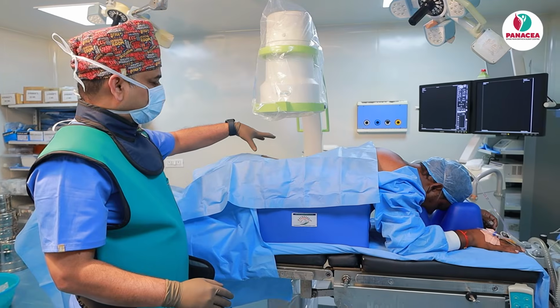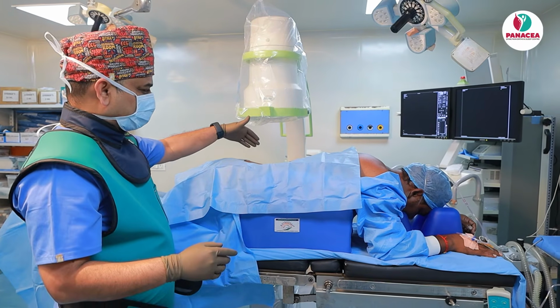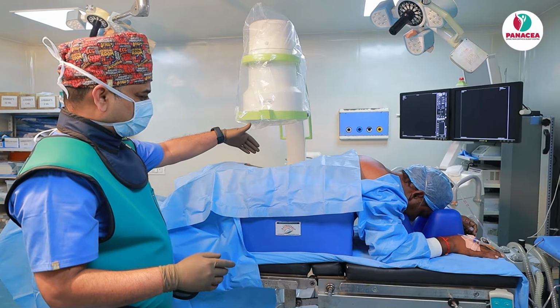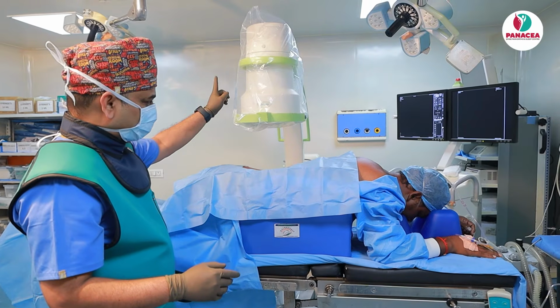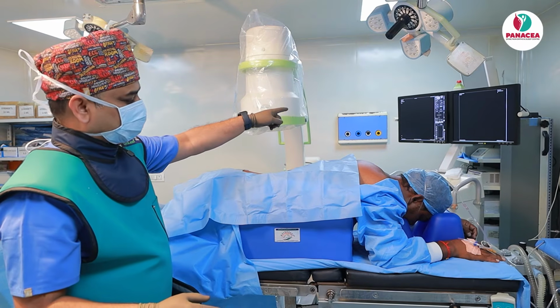Now it is scrubbed and draped. You can see the ergonomics. The patient has got left side symptoms, and we're going to do the pain intervention from the left side. So the C-arm is also on the left side, and the monitor for viewing the fluoroscopy is also on the left side. This is the ergonomics.